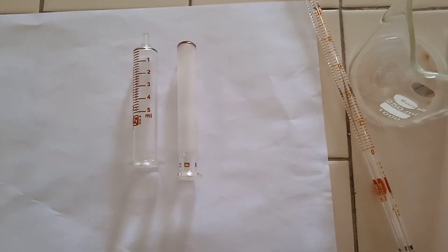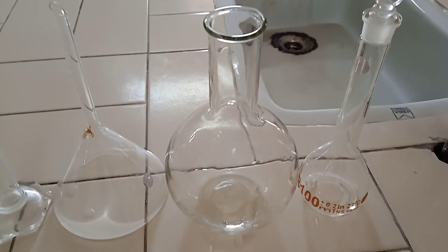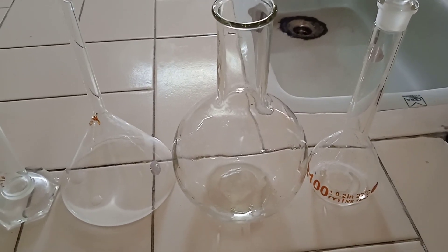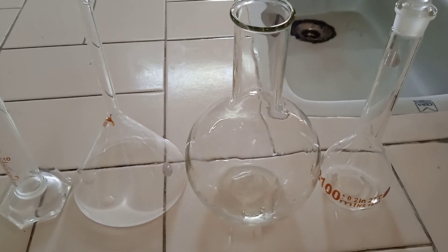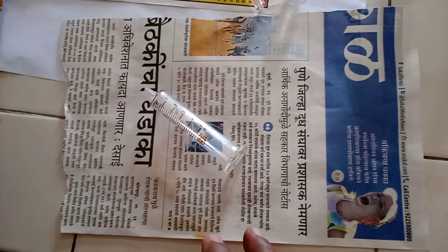Here you can see I have taken the syringes, pipette, beaker, measuring cylinder, funnel, round bottom flask, and volumetric flask, which I have already cleaned and dried in the hot air oven. Now I will wrap them and keep them in the hot air oven for sterilization.